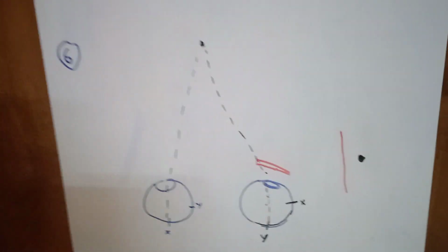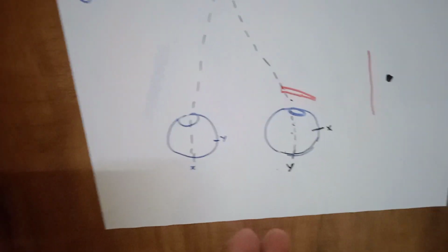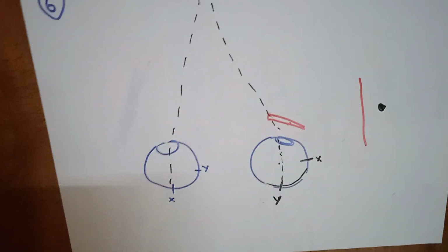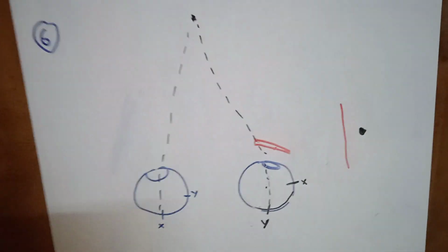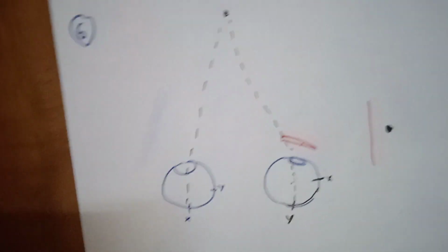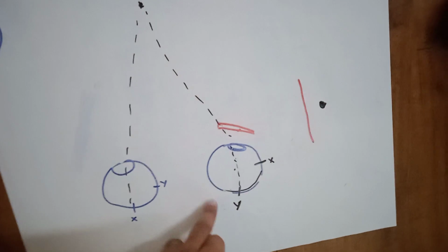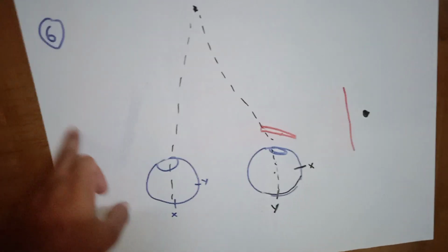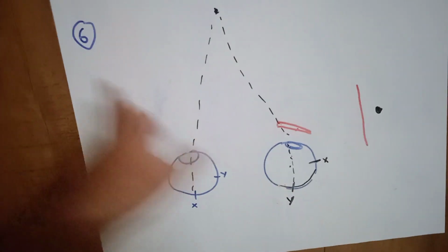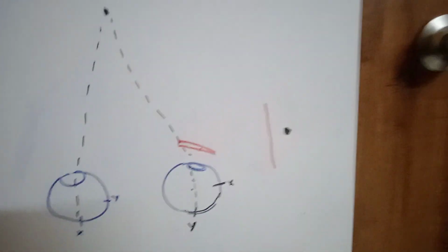And now for the exophoria. Now remember please that I have made these diagrams as a very big exaggeration. It is not like this word for word, but the concept is similar. Now, since the eye is turned out and the light is falling on Y, which was supposed to be here, your brain will think it is coming from this side. So the rod will be seen to the left of the dot. And that is how you differentiate between esophoria and exophoria.